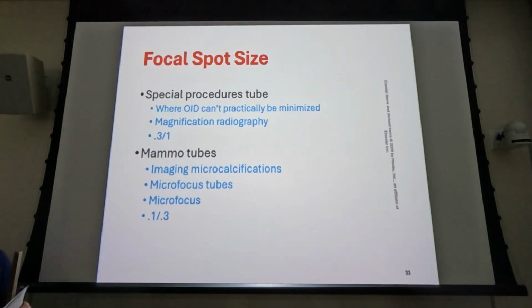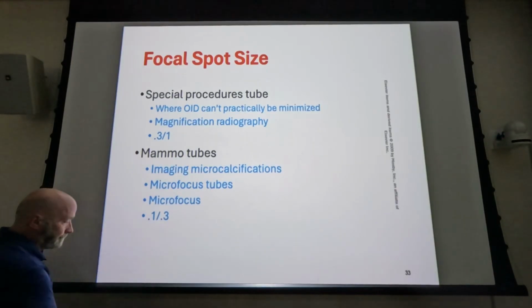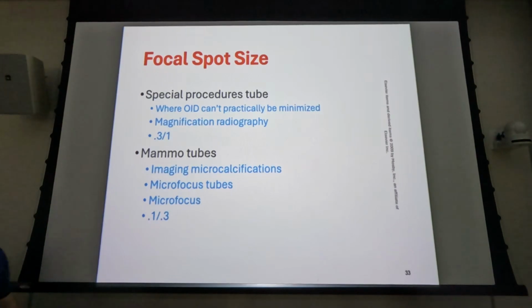So one of the main purposes for macro radiography is to have the magnification. When we have an increase in OID and presence of air gap, we increase SID to get rid of some of the magnification. Okay? So don't miss that on the test either, be it this test or in the spring semester.